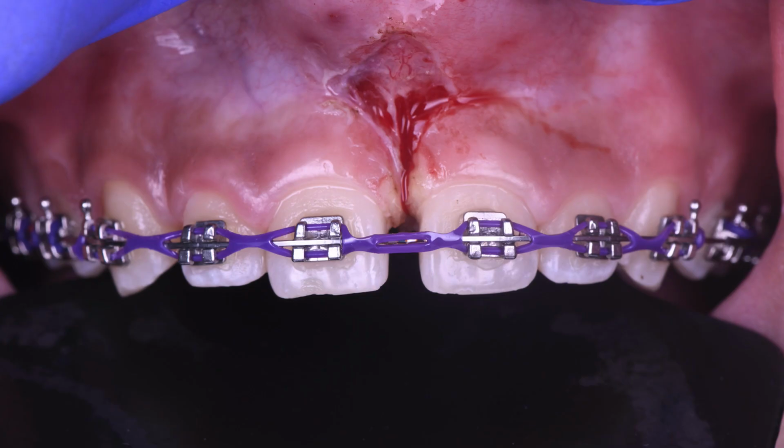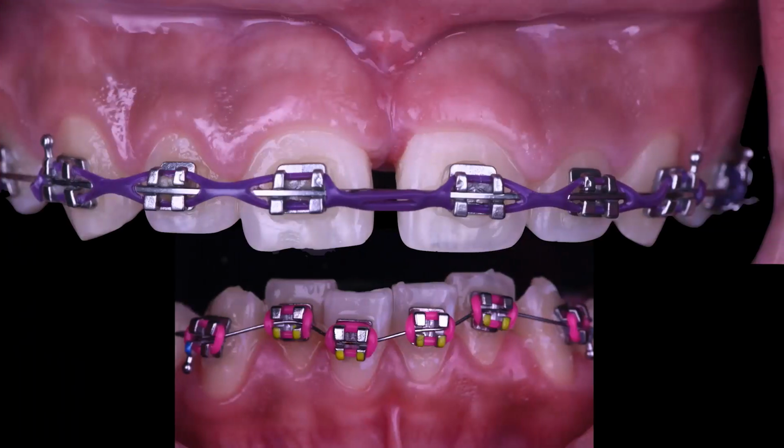And here there is one hole in the chain because the power chain was stretched between the two central incisors. So I left one hole between the two centrals, and after 1 month I removed this hole and connected the power chain completely. Then I started the lower arch.